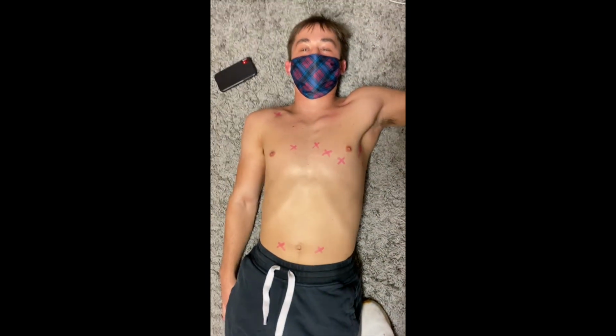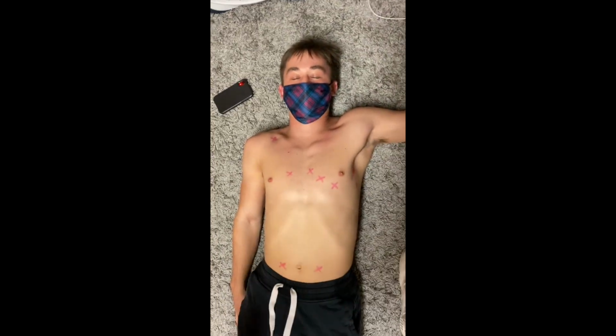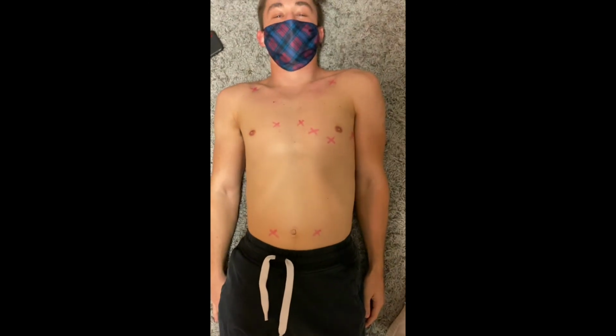this is how you place all the leads for a 12-lead EKG, all 10 positions. Josh, please put your arm down so I can see the top one. There we go. All right, thank you very much.